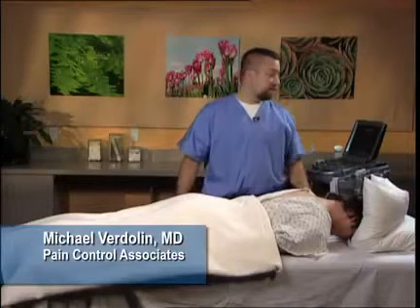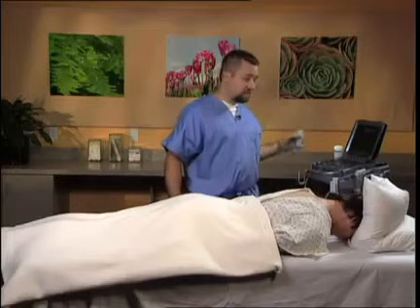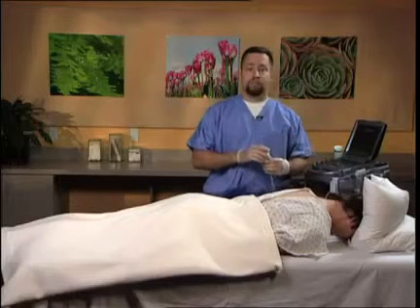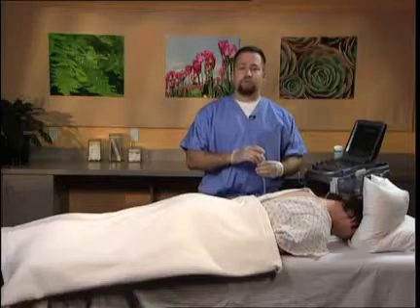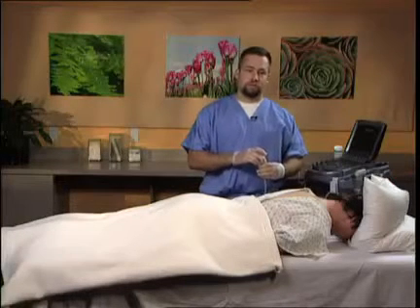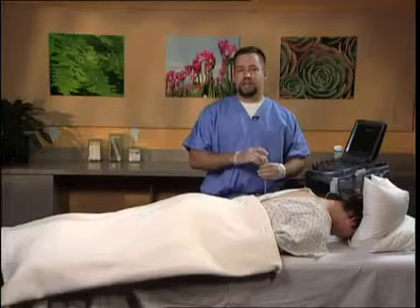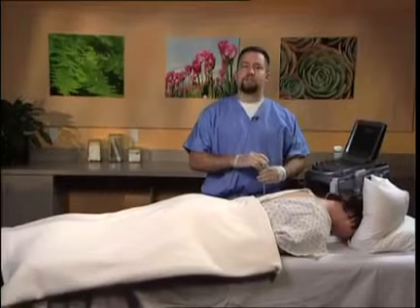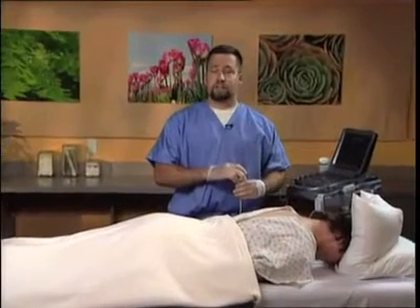Today I will perform an anatomic demonstration of the cervical spine utilizing the M-Turbo ultrasound system utilizing the C60 curvilinear probe. The point of this exercise is to demonstrate the anatomic considerations when performing cervical epidural steroid injections and cervical facet injections. Typical patients may have a variance in their anatomy, and the traditional approaches utilizing loss of resistance techniques for cervical epidural steroids can present some challenges.